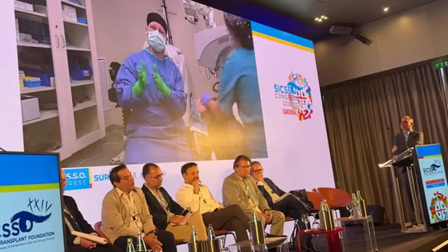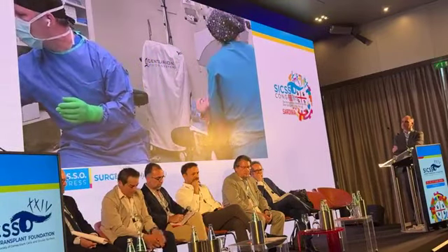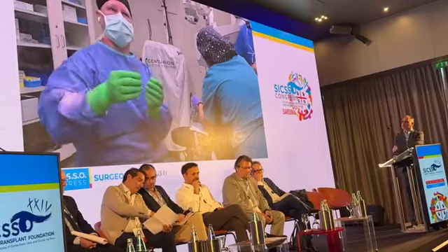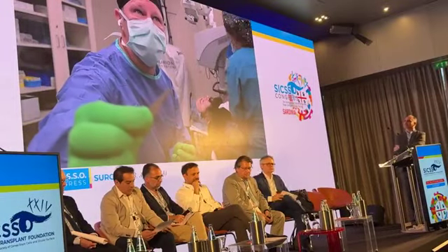And they'll ask you to measure either over or down a certain number of millimeters, and that's where you use these little calipers. Let me take these little, so they have these small calipers. I'll see if I can get this closer to you. It'll be hard to get that in focus.